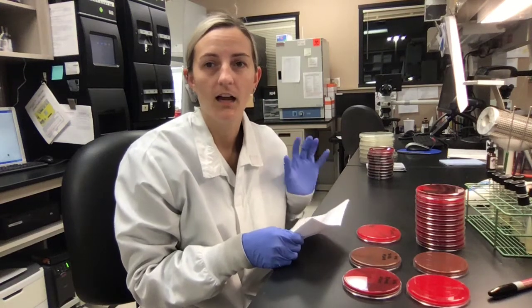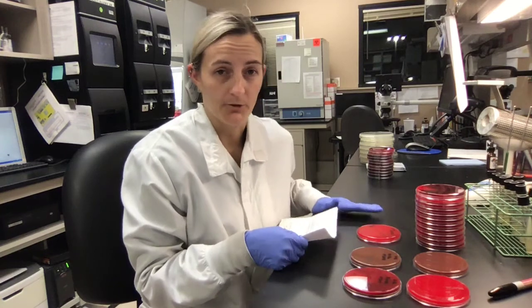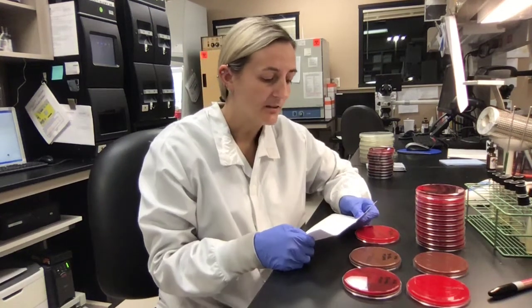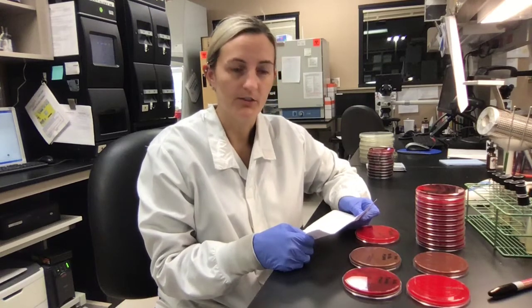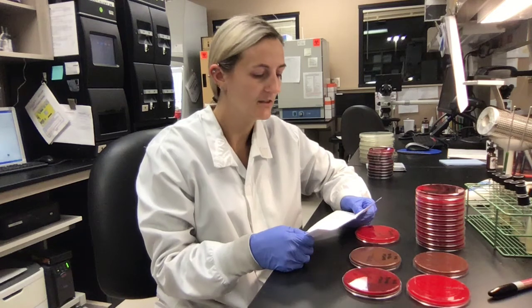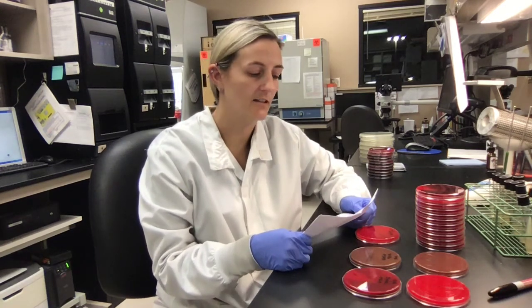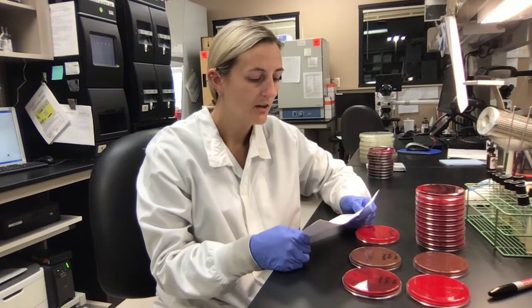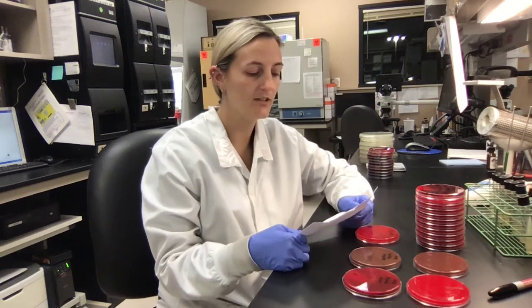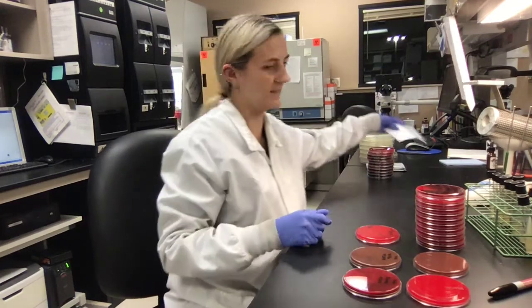Today I'm going to be showing you how to perform weekly QC in micro. My first objective is that at the completion of this video, microbiology technicians and technologists will be able to perform weekly routine Kirby-Bauer quality control testing. My second objective is that they will also be able to perform weekly routine Vitek organism quality control testing.